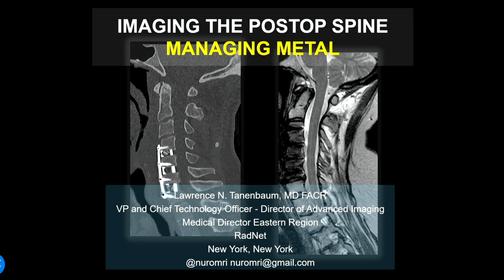So, anybody ever image anybody with metal in the spine? You think that ever happens? You know, it happens an awful lot. As a matter of fact, as we get older and older, as the population ages, the incidence of implants within the body increases. These not only complicate your imaging procedures, which is what we're going to talk about today, but make it difficult to even get patients on the scanners when it comes to conditional implants with MR. It's quite a challenge. So it's a big deal. We're all imaging a lot more patients with metal.